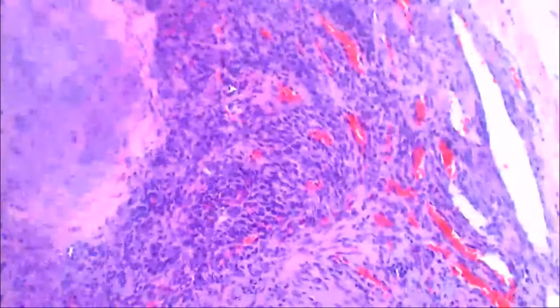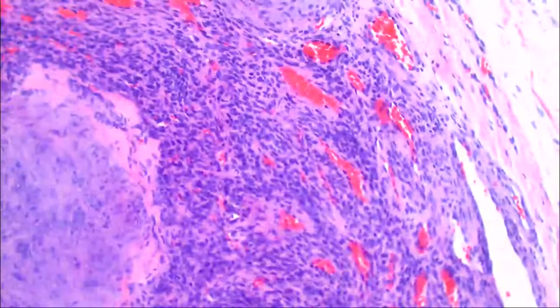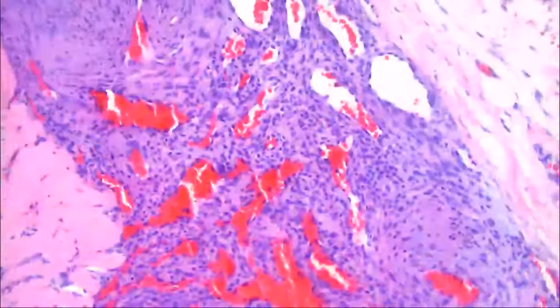Well, there's a thing called a hemangiopericytoma. These lesions often have a hemangiopericytoma, myopericytoma component at the periphery, like you see here. And then they've got the myofibroma over here. So it's the same lesion, it just has features that kind of look like a hemangiopericytoma in some areas, and then the more myofibroma-like areas over here. Beautiful, gorgeous, fantastic example of this.